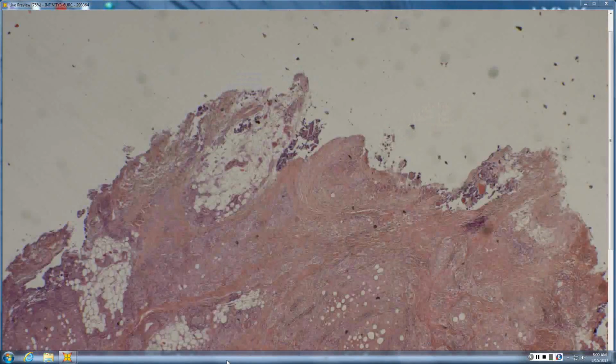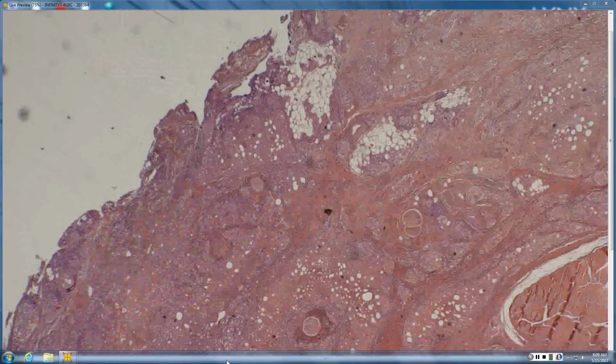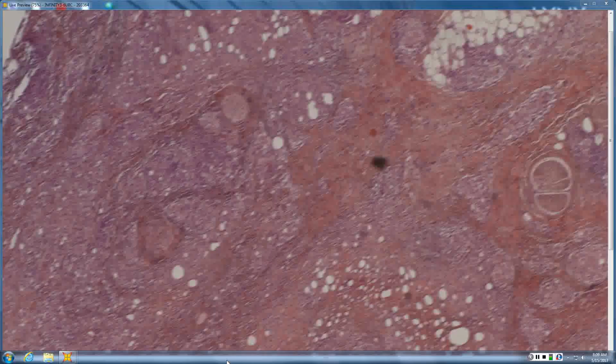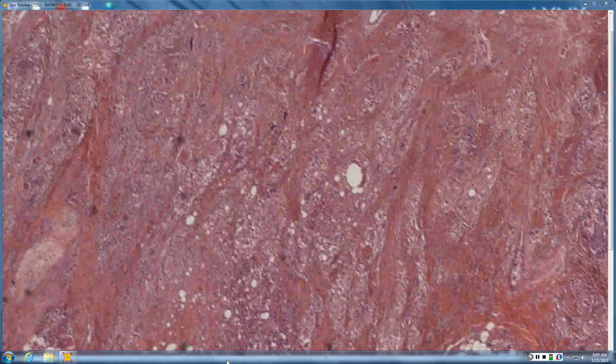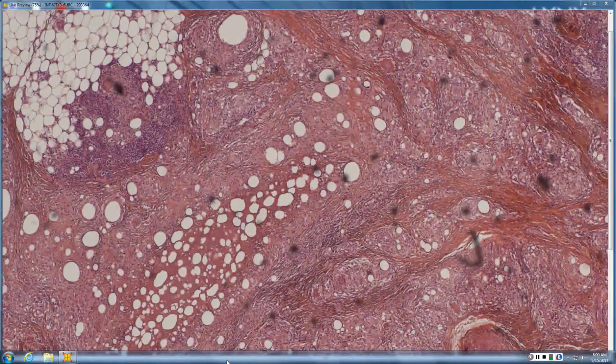Okay, so here I'm going to walk you through this. There are lots of granuloma, lots of inflammatory, and then lots of these vacuoles, right? So your question is, what's in the vacuole? Could this be a lipogranuloma? What got injected? And in this case, it was hydraulic fluid injection. Oh my god.